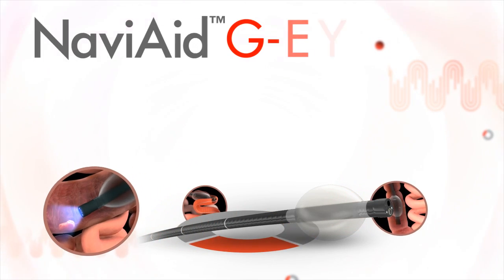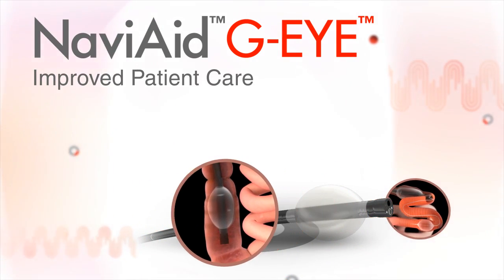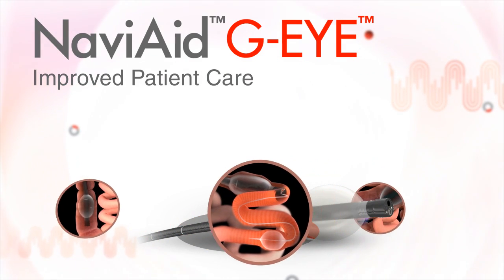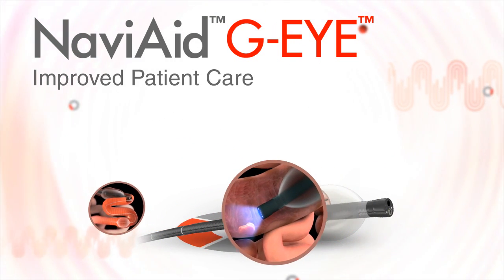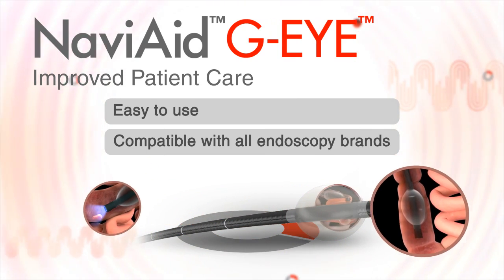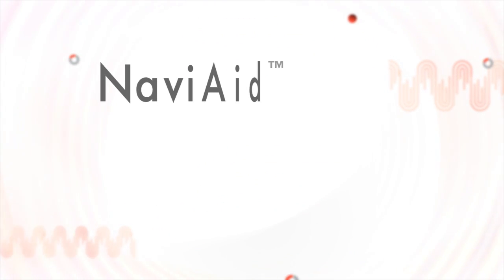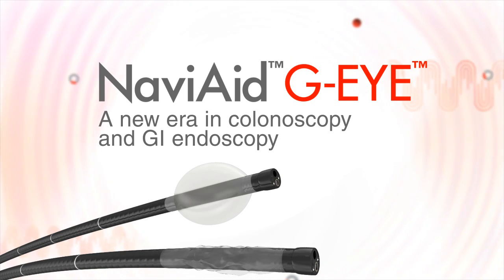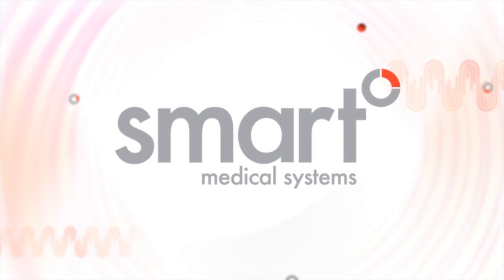The NaviAid G-EYE provides substantial clinical benefits and improved patient care in a variety of key endoscopy applications. It increases detection yield and is important in every colonoscopy, as well as in various other endoscopy procedures. It is simple to learn and use, and is compatible with all endoscopy brands. NaviAid G-EYE — a new era in colonoscopy and GI endoscopy. By Smart Medical Systems, endoscopy the smart way.